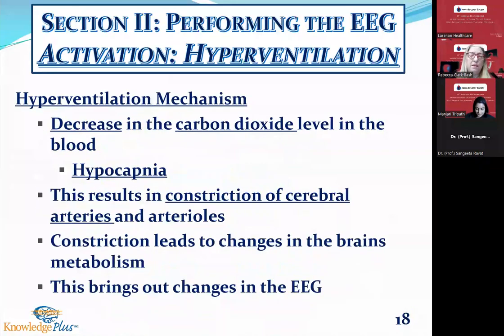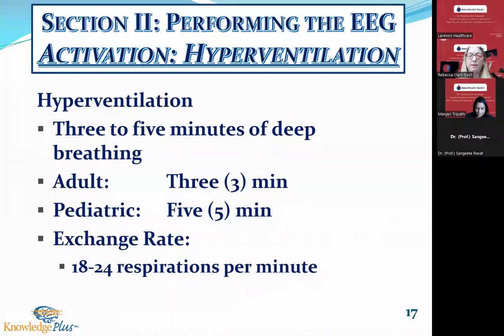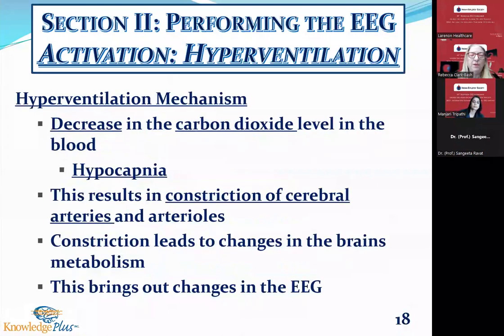What happens? Again, I want to just make one more point. It's the same point I've made through this slide. It is really important when behavior, attention, academic performance, when those three features come up in a history, it's important to do not only the 5-minute HV at the beginning of the test, but also after you've tried to get them to sleep, have them HV again. And you can make it really fun playing the game. We're racing, I'm winning, yet she's sitting there on the bed with her eyes closed.